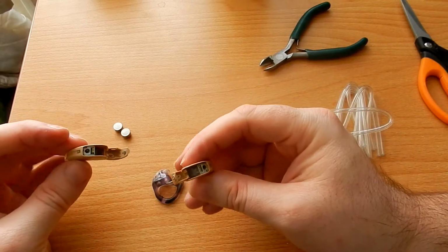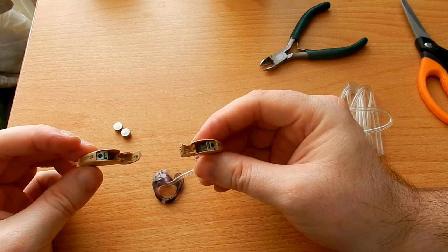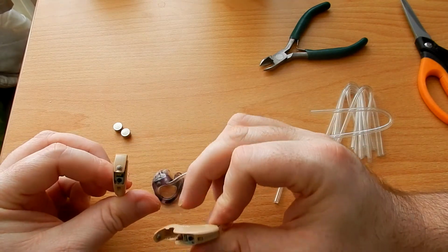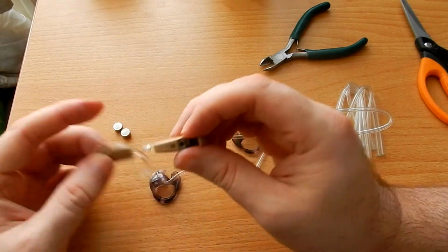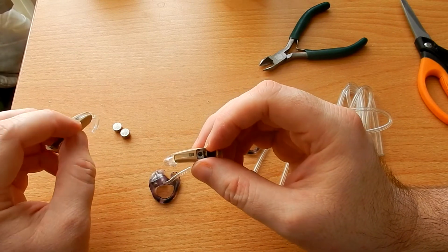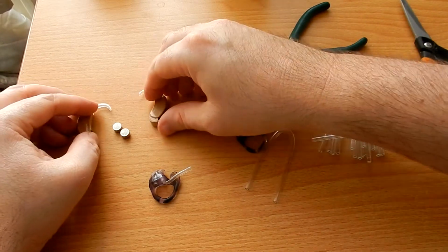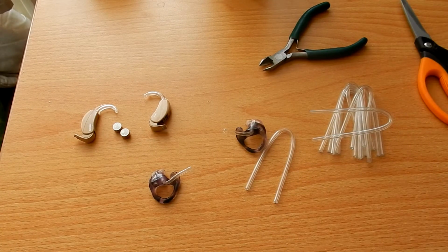Thing is, you've got to remember which ones are which. On these hearing aids, this one is your left one, that's blue, and this one's your right hand side one. So what I'll do is leave them there in that position so I can remember.